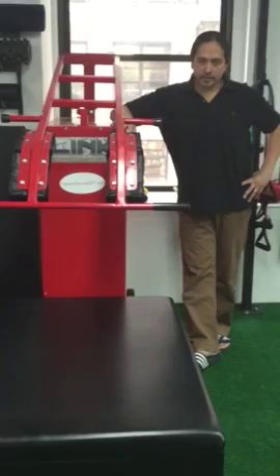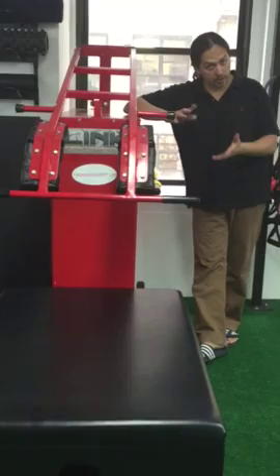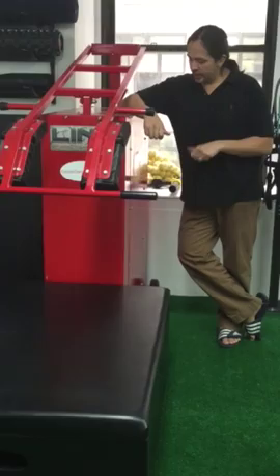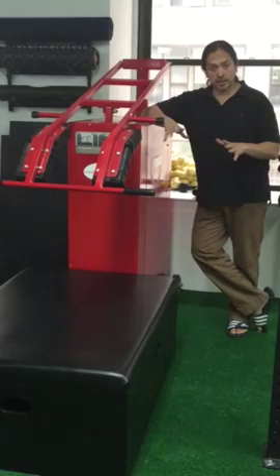With the isokinetic accelerator you can keep firing through the concentric motion at whatever point you want — the acceleration phase, the terminal velocity phase. You can do a series of one-rep maxes if you want, just going for maximum effort. Just establish your rhythm — it's completely safe.